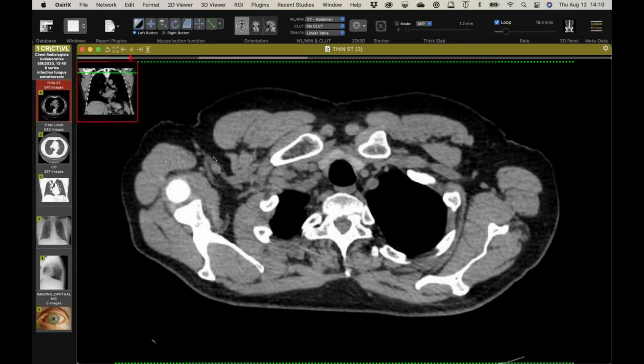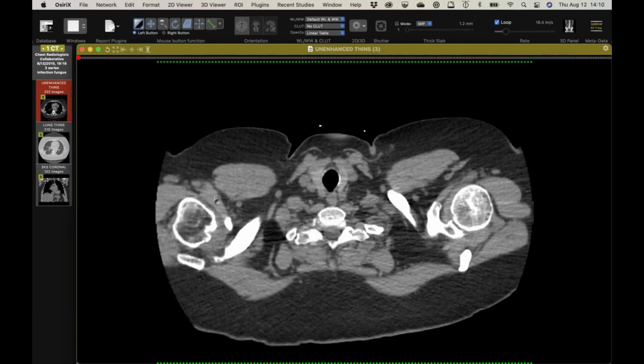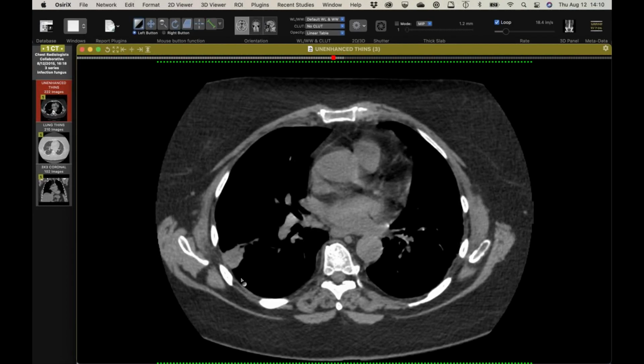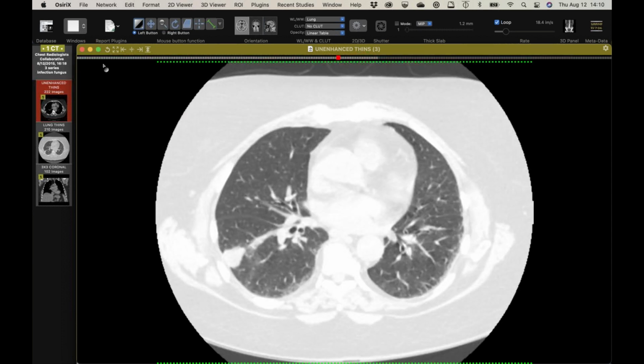So, a case of cocci, with the lung involvement being pretty minimal. And while I'm at it, I have another case of cocci that presented at the same time. This is more typical of what we might see with histo, with a dominant nodule here, with some lymphatic nodules draining along it. But the travel to endemic areas for us is sufficient.